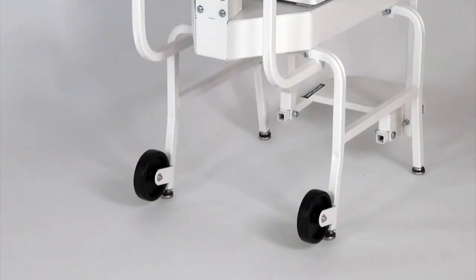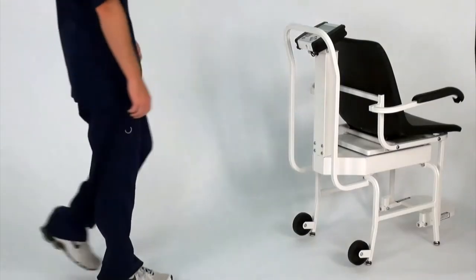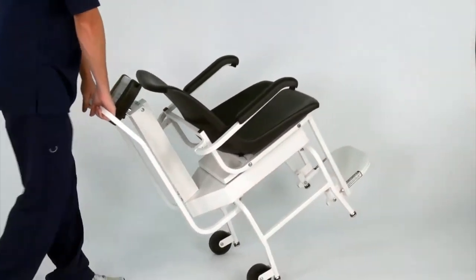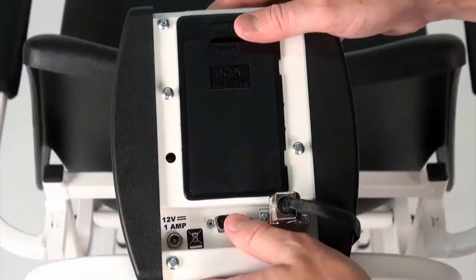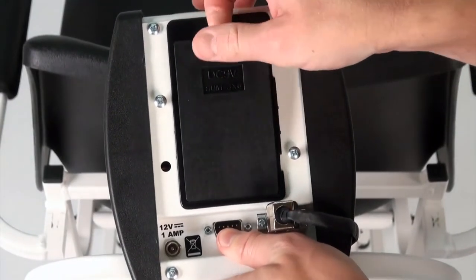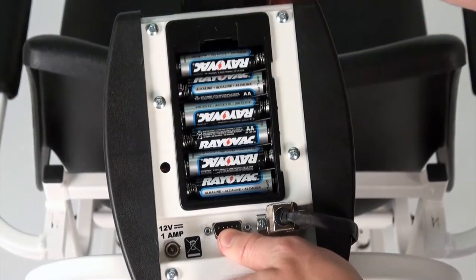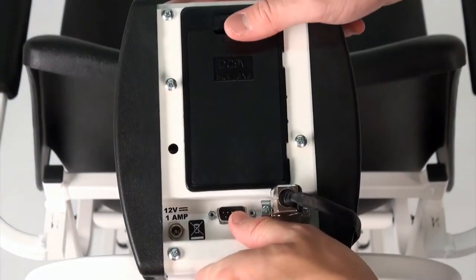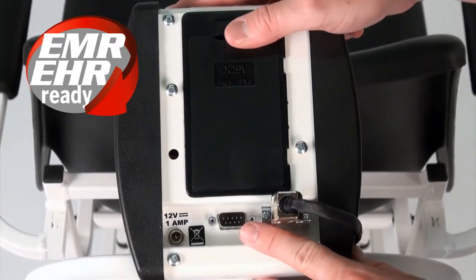The 6475 is conveniently portable with built-in rear wheels and transport handle, so it may be moved to wherever your weighing needs are located, offering a mobile advantage. 6 AA batteries make this chair scale perfect for all clinics, hospitals, and physician offices. An RS232 serial port provides EMR/EHR connectivity for efficient patient record keeping.